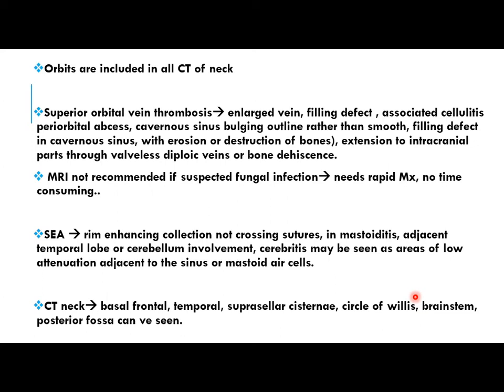Actually, MRI is not recommended if we suspect a fungal infection because it's an emergency condition, and we have to go directly to the management, because MRI, as we say, is time consuming and takes more time. And in the epidural abscess, we talked about that.